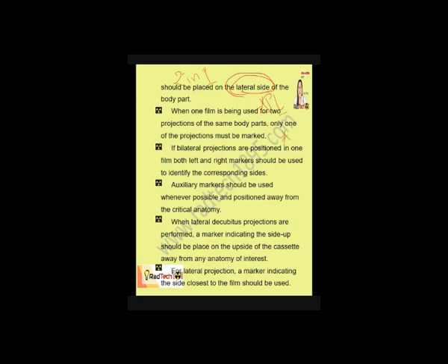Halimbawa, sa AP exposure, maglalagay ka doon ng left, which indicates halimbawa that is the left hand of the patient. Or sa lateral ka maglalagay ng marker, lagyan mo siya halimbawa kapag right naman, so lagyan mo ng right na marker.